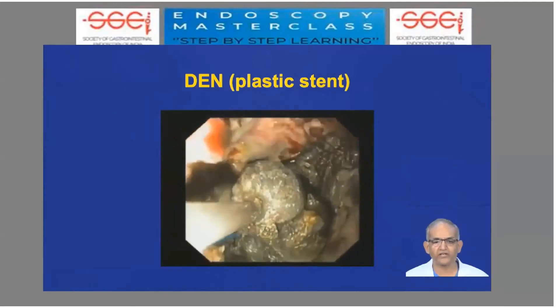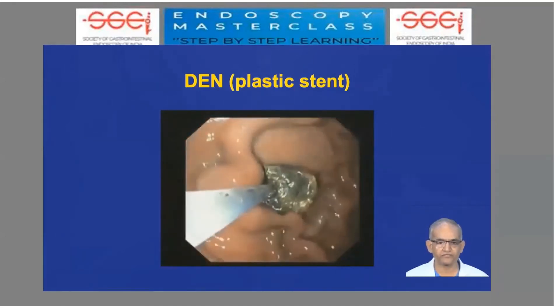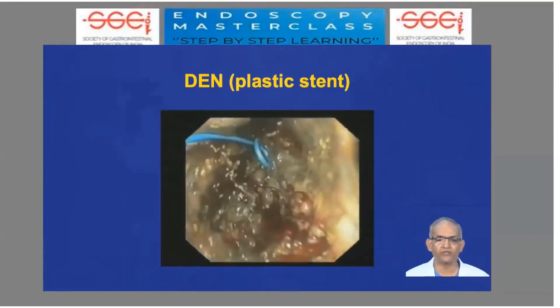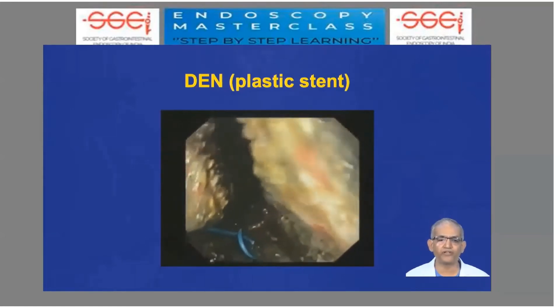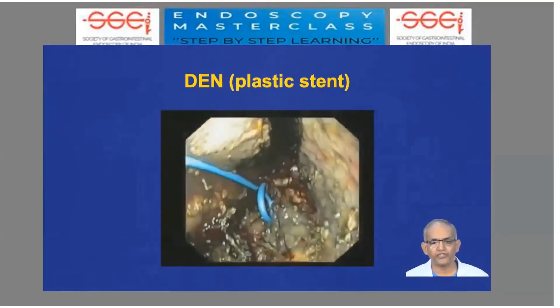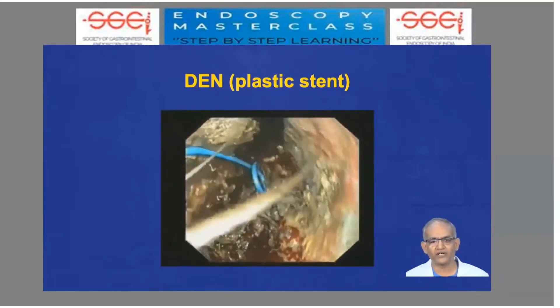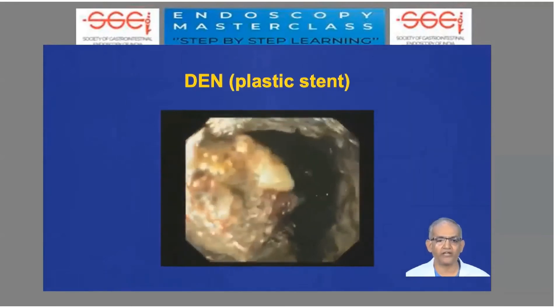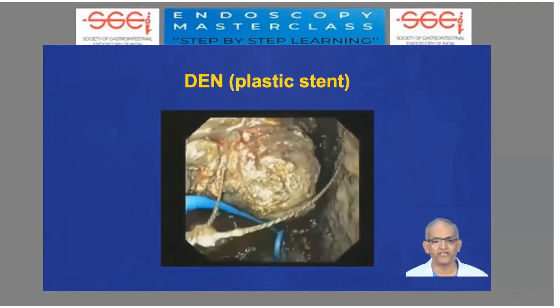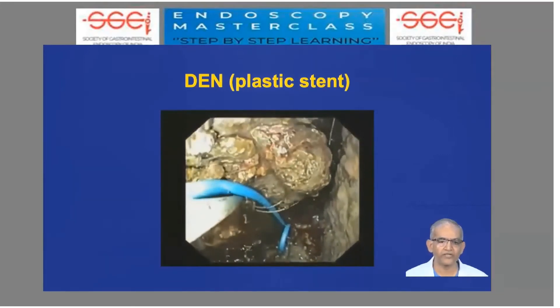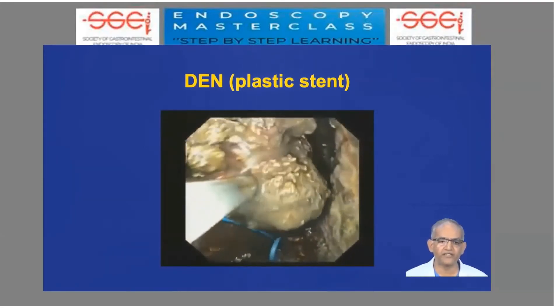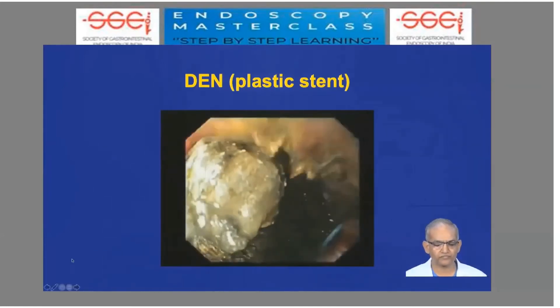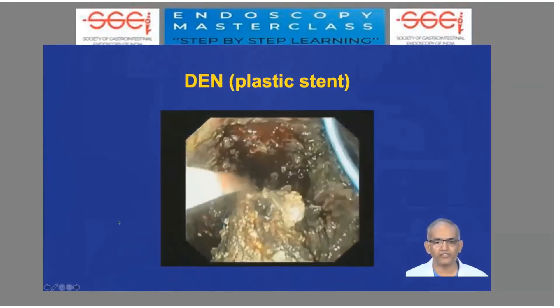Sometimes the debris can be left inside the stomach, or if a big chunk comes out you can pull out the scope and re-intubate the patient. The patient is generally in conscious sedation under propofol, but if required, you can do it under general anesthesia with endotracheal intubation as well. As you can see here, several devices have been used — started with basket, now a snare is being used, and forceps can also be used. A blend of devices should be available.